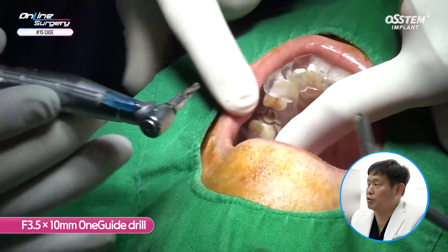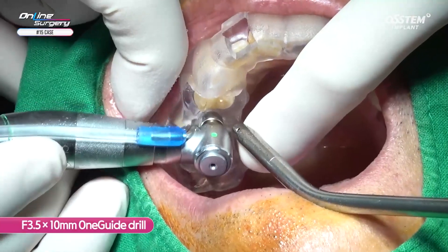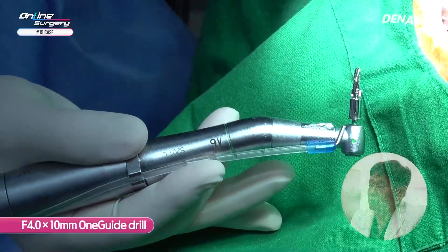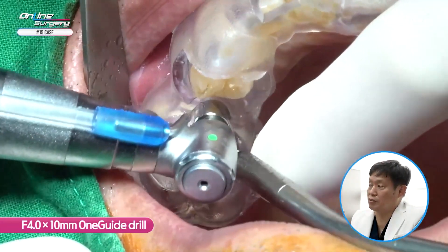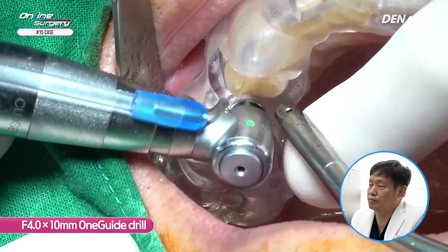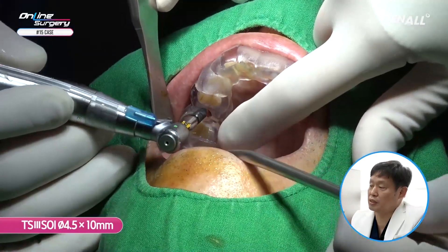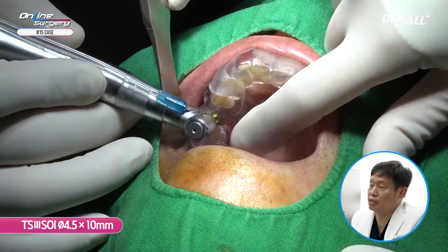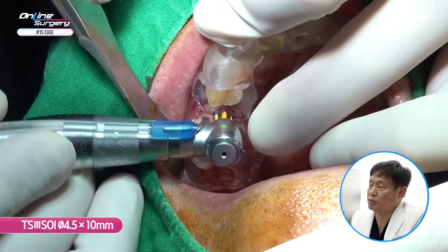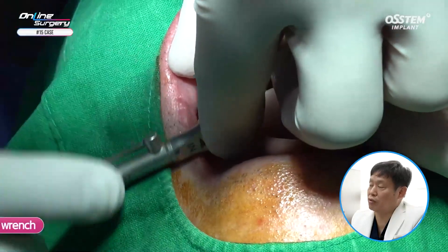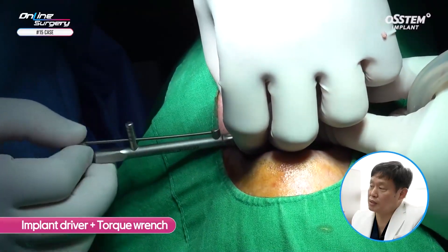Next, a 3.5 by 10 mm OneGuide drill is used. The bone was still soft, therefore a 4.0 by 10 mm drill was used as a final drill. I'm only drilling up to 4.0, and after that the implant was placed — a TS3 implant with SOI surface. A 4.5 by 10 mm implant is placed. Because it is a SOI implant, I am not irrigating. I'm using the engine at 80%, making sure the stand does not move. The hand wrench is used to get the final position.